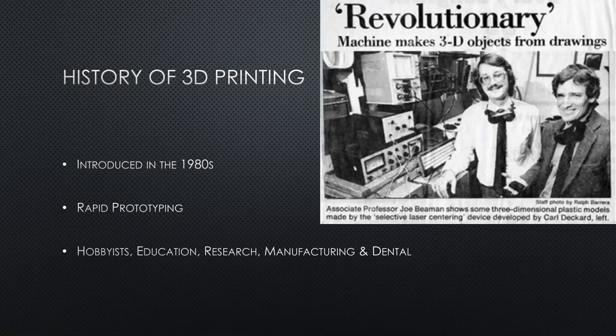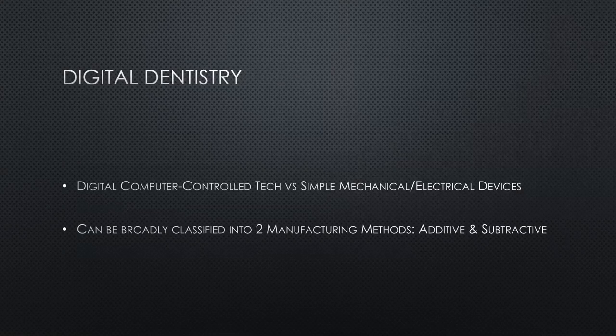3D printing wouldn't be possible without the advent of digital dentistry. Digital is kind of a buzzword for any kind of new and exciting technology in dentistry. But at its core, the invention of CAD-CAM for use in dentistry and the use of digital computer-controlled technologies versus simple mechanical or electrical tools has been absolutely revolutionary. Digital manufacturing pathways in dentistry can be broadly classified into two categories, additive and subtractive.